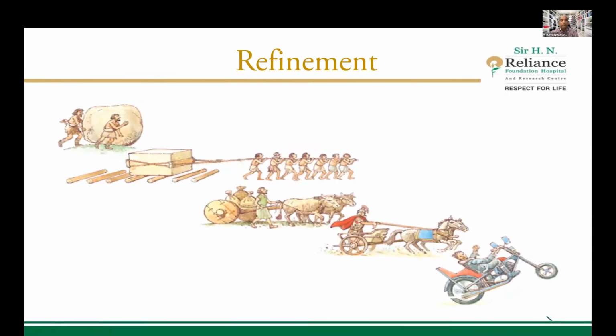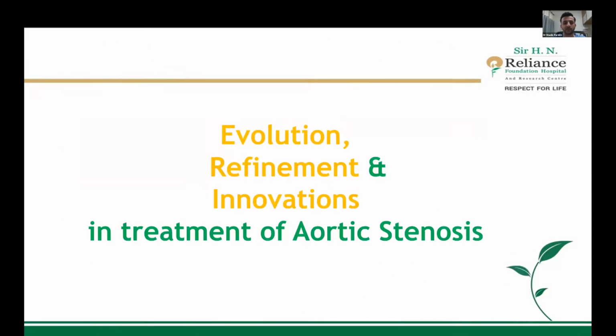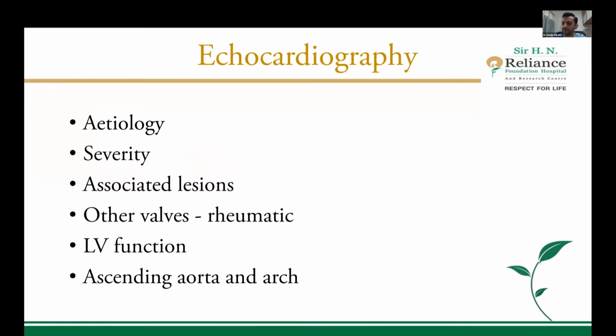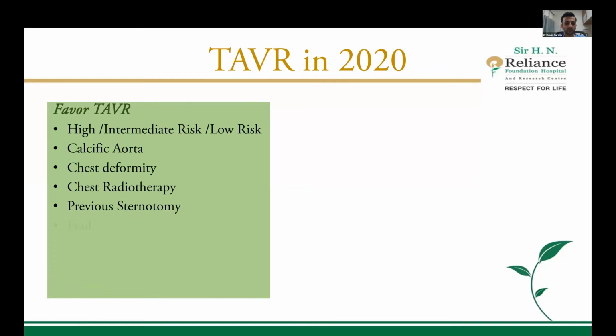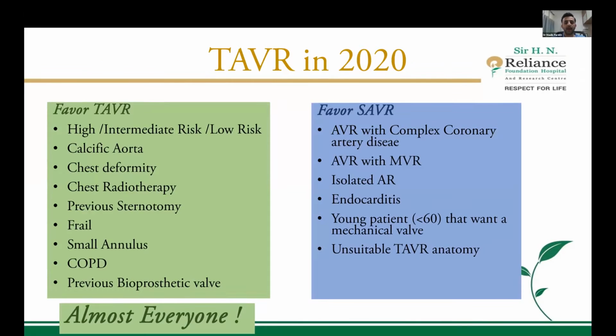Okay. Yeah, so I will skip the initial part of the presentation because Dr. Nasir has done an extremely good job, and I don't have to harp on any of that. So I'm starting my timer now. So we all know that USFDA has approved TAVI valves for extreme risk, intermediate risk, and low risk in these months. So this is, I think, what Dr. Nasir already discussed, and I'll just go to the cases.